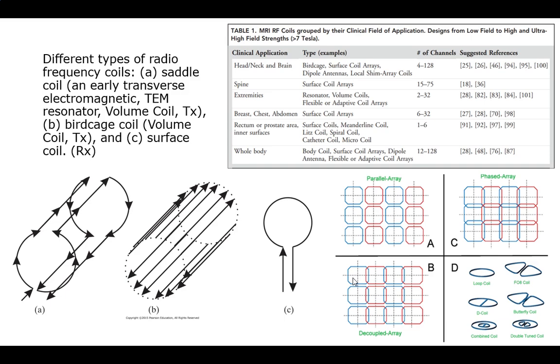So typically you would have type C over there. Those are receiver coils. They're called surface coils because they're best against the surface of the patient. That's their primary area. The book only shows you those two types. I included this one also because these are basically arrays of these. But these coil arrays are actually the nicest way to do it. I'll show you some pictures later that show the differences in quality you can get with these multi-coil arrays.